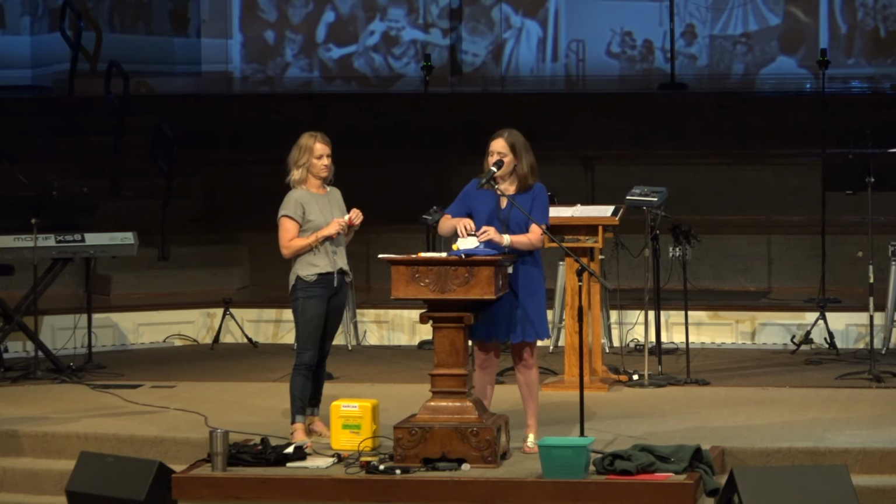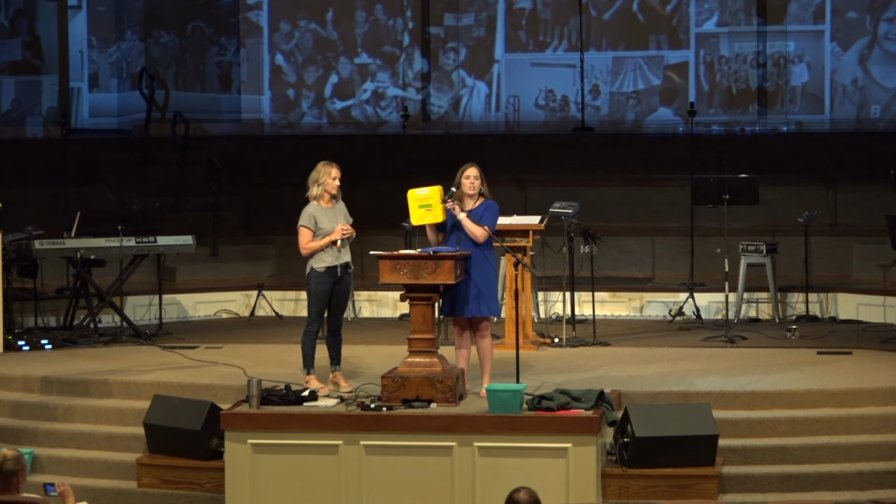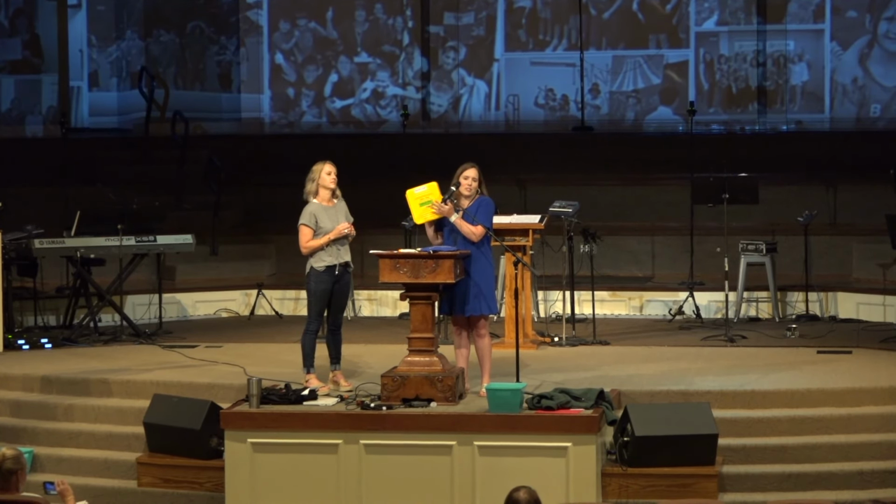The packs have been broken up, and you'll have one junior, one regular in each location. Some are in this yellow container, like this. Most of the time, if you only have one AED, you're going to have another location that has a yellow container. There's actually a breakaway tab that you can just break and open it up. It's not locked or anything like that. It just has a breakaway tab, so students don't just open it and go into it. This is also where your NARCAN will be housed.